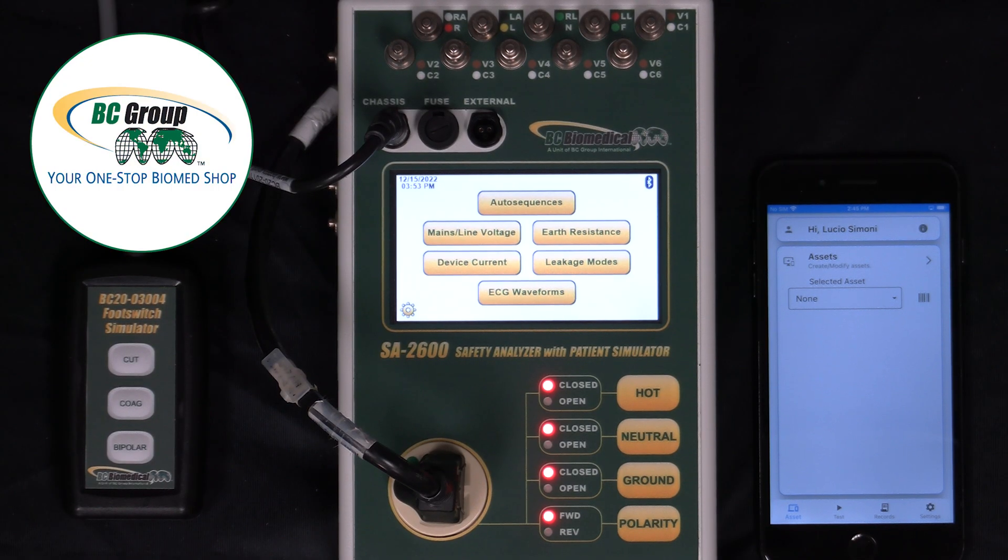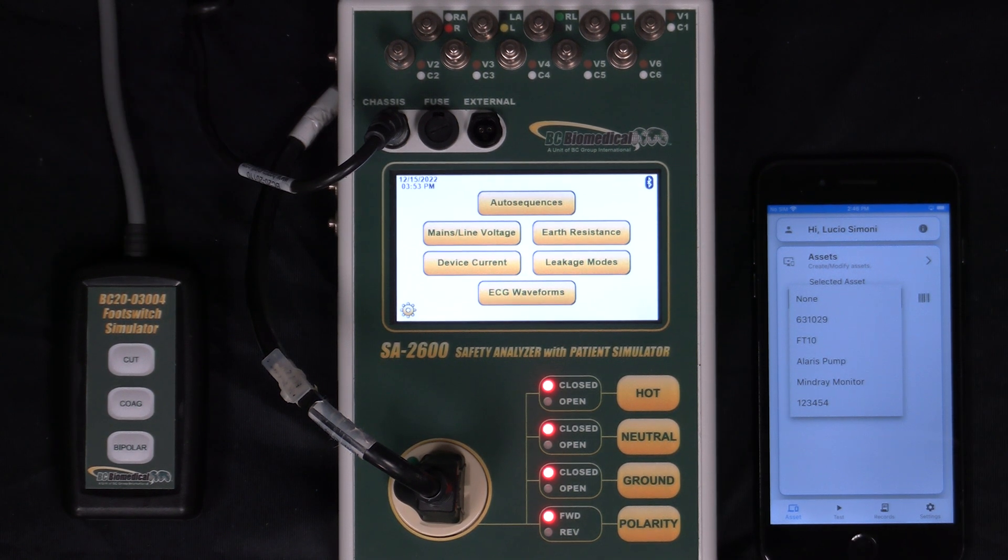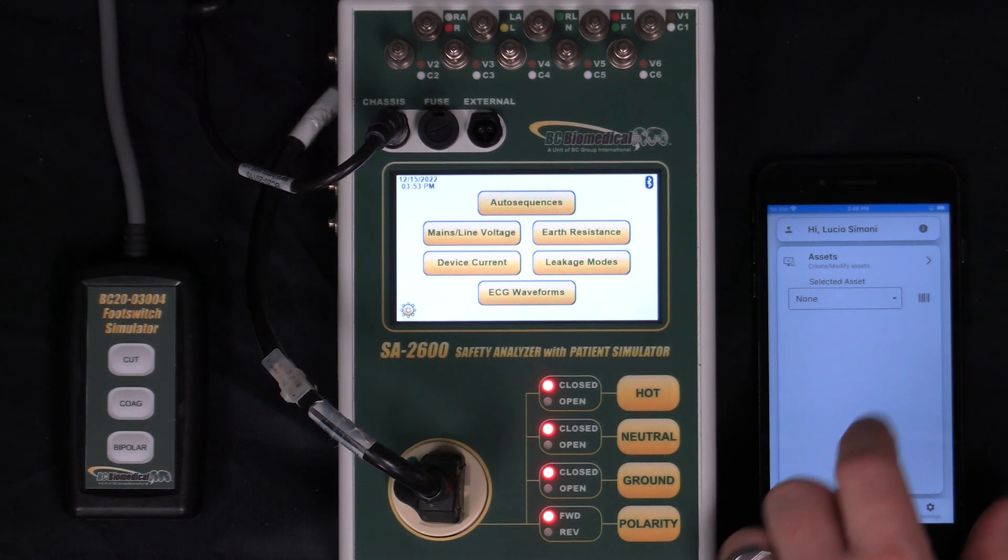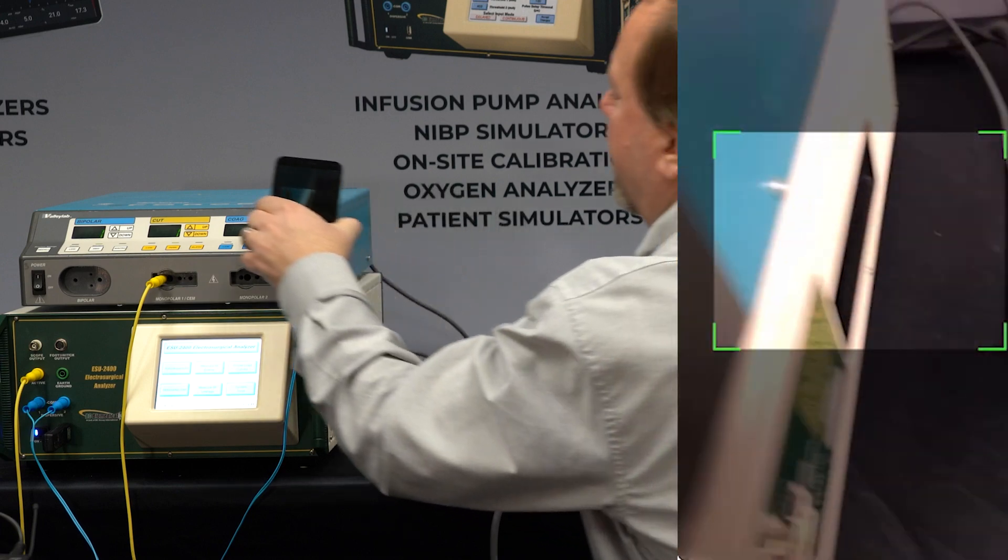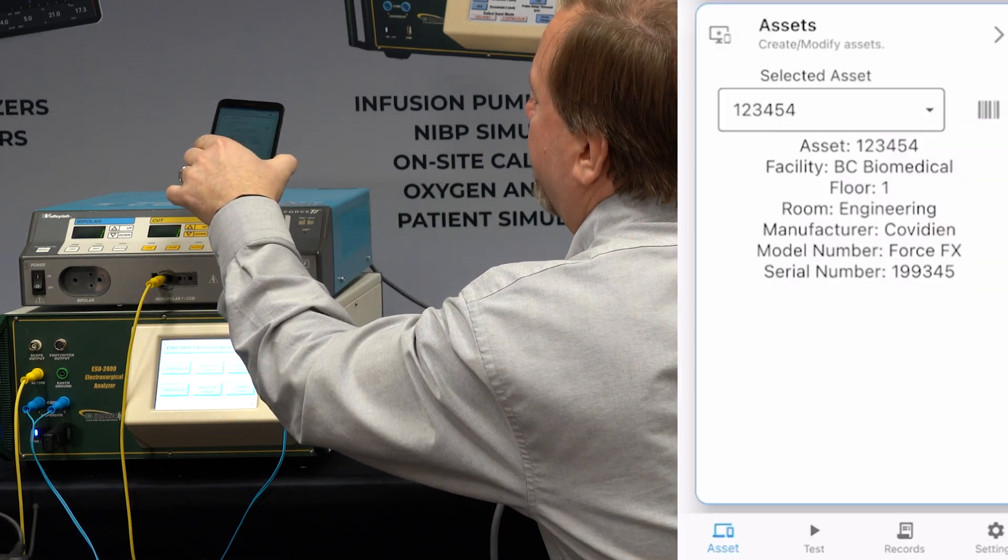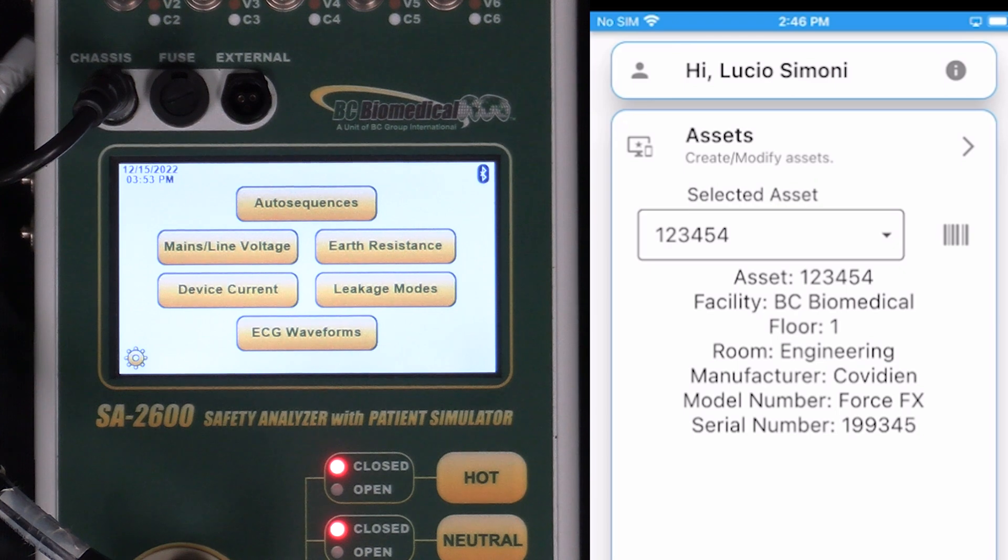The first thing I want to do on MyBC Mobile is select the asset that I'm testing. We can do that either by selecting the drop down list or we can use the barcode scanner. I just press on the barcode and then I scan the barcode on the device I'm testing and MyBC Mobile is loaded with that asset information.